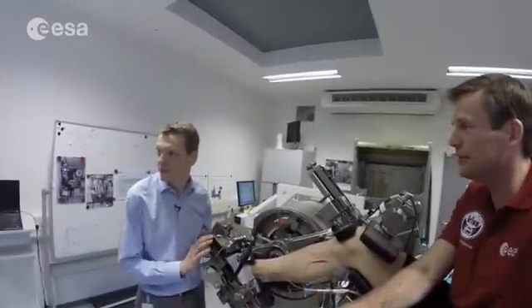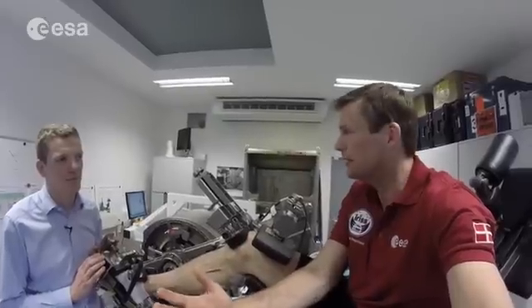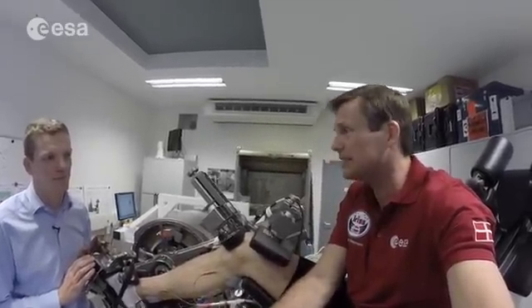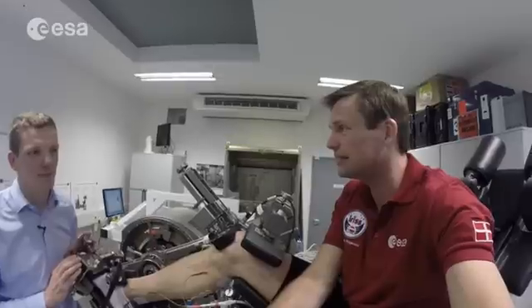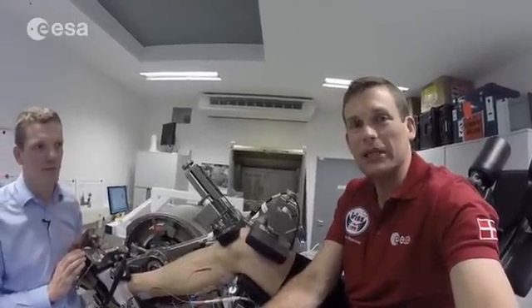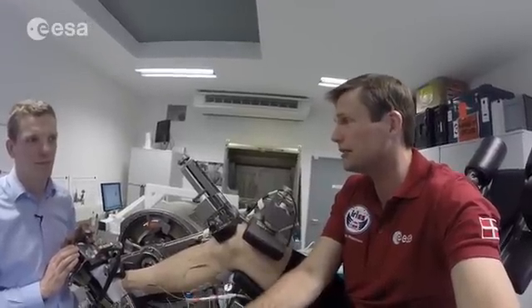All right, I'm back at EAC, this time with Olivier. I'm sitting in MARS, which is the Muscle Atrophy Research and Exercise System. It's actually going to be one of the biggest activities during my mission on board the space station. This is an important piece of European hardware, which we'll be using in the future to do research on muscle atrophy on the astronauts. You want to tell us a little bit about it?